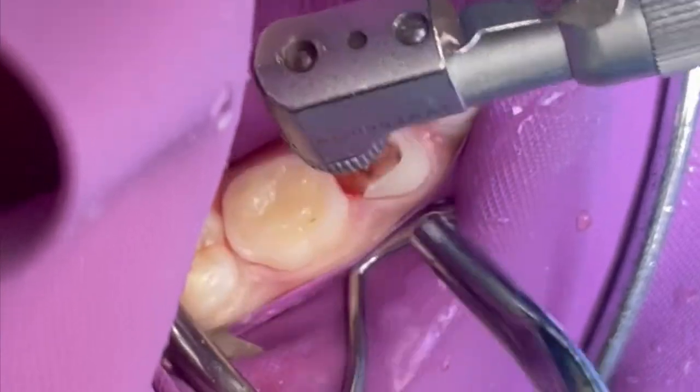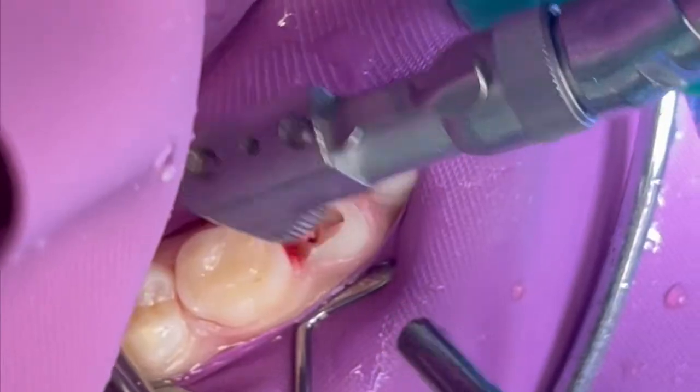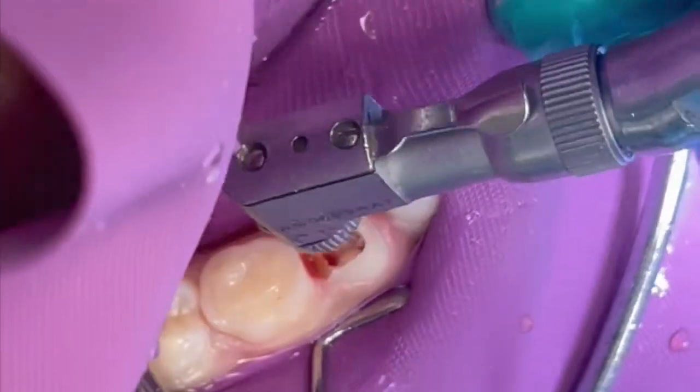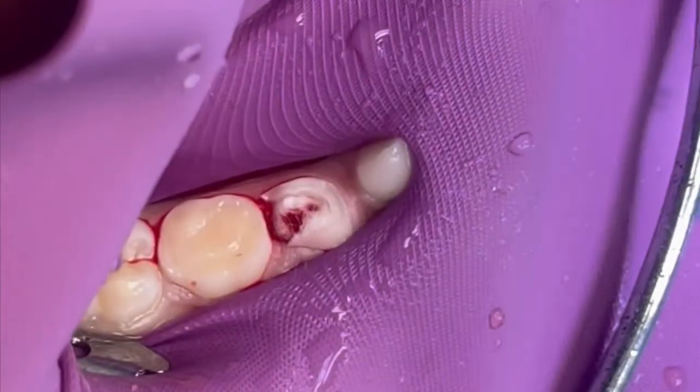Our next step, once we're done removing the excess tissue, is controlling bleeding, and we're going to do that with some cotton pellets. The next step in the instructions for use is to control hemorrhage using a solution of your choice: sterile saline, sodium hypochlorite 1.25 to 6 percent, or chlorhexidine. If hemorrhaging is still present at 10 minutes, the diagnosis is irreversible pulpitis, and a full pulpectomy with obturation needs to be performed or other restorative choices considered.